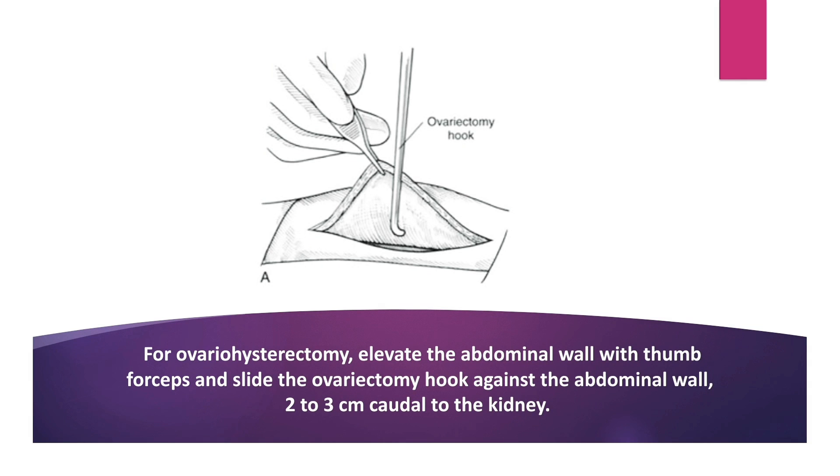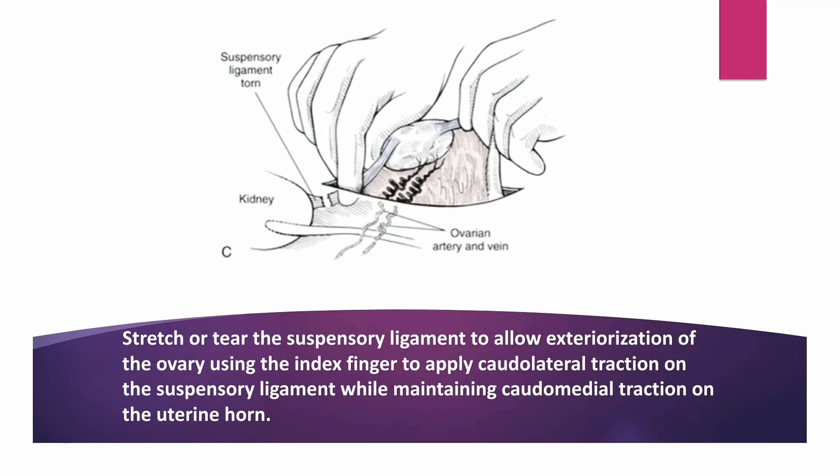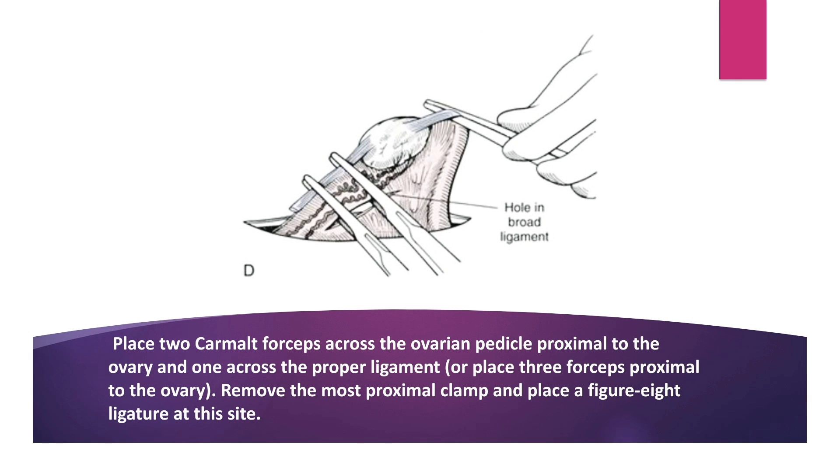For ovariohysterectomy, elevate the abdominal wall with thumb forceps and slide the ovariohysterectomy hook against the abdominal wall 2-3cm caudal to the kidney. Then exteriorize the uterine horn with the hook and identify the suspensory ligament at the cranial edge of the ovary pedicle. Stretch or tear the suspensory ligament to allow exteriorization of the ovary, using the index finger to apply caudolateral traction on the suspensory ligament while maintaining caudomedial traction on the uterine horn.